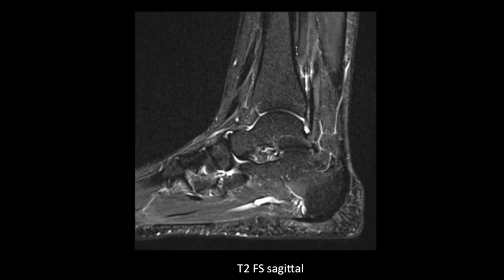We take the T2 fat saturated sagittal images first. Look for bone marrow edema, soft tissue edema, joint effusion, or fluid along the tendon sheath on these images. This will help you to localize the area of abnormality in the ankle joint, and then you can look at the proton density images for the cause of the abnormality.